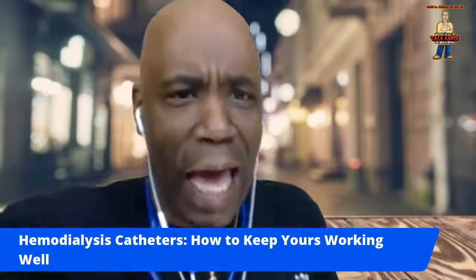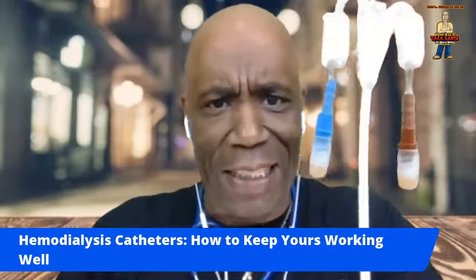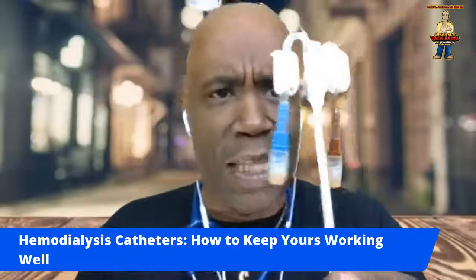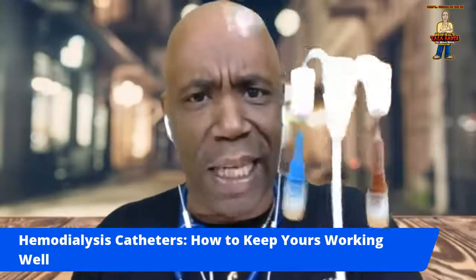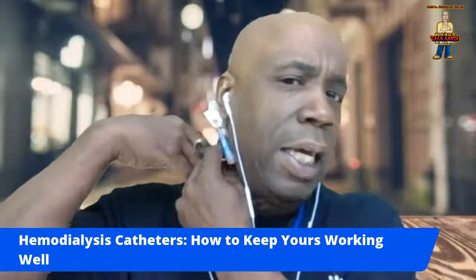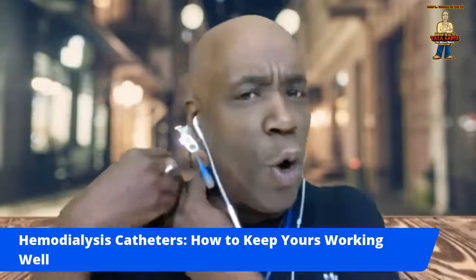Now you have another access for emergent access. That's this, which is called the IJ. And this is inserted in your jugular vein on the side of your neck. I've heard many warriors say this is very uncomfortable because when it's in your neck, it's taped, it's sutured down. And when you're moving around, you know, it's moving with you.